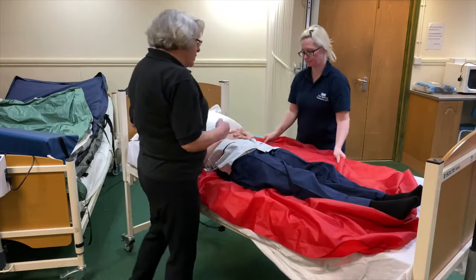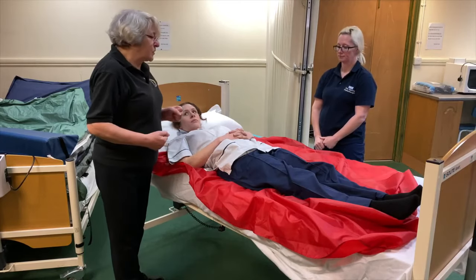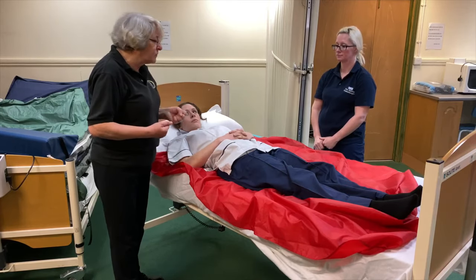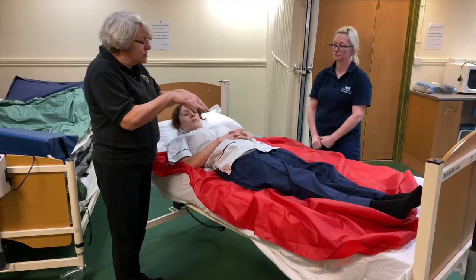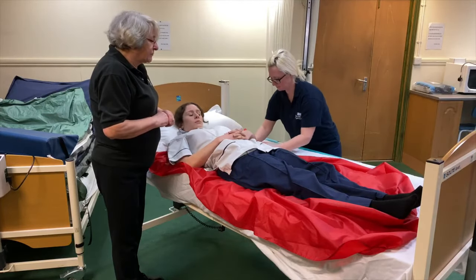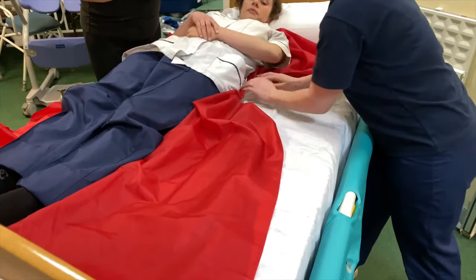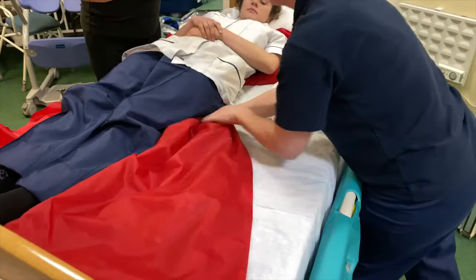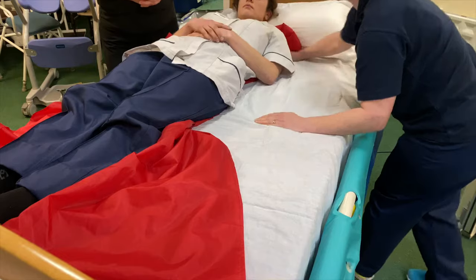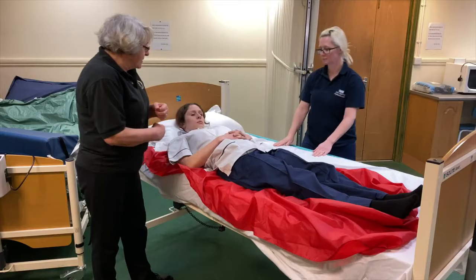Okay, so now she's on this side of the bed, and just because of weight distribution, we do not want her lying on the slide sheet because this is not a leave-in system. So Lisa is going to push the slide sheet under Alice's side, basically so that when she does roll, she is not lying on it. Just give yourself a little cuddle.